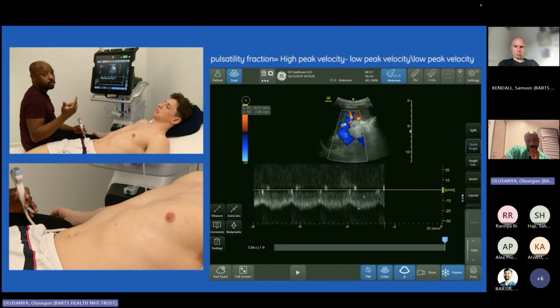So that's not pumping very well at all, is it? You look in the short axis, and the systolic function is equally bad. You put some color on. Looks like there's quite significant LV dilatation, and there's probably at least moderate MR secondary to the dilatation, so what we call secondary MR. It also looks like there's some tricuspid regurgitation there, and it also looks like there's terrible right ventricular function as well, and both atria are dilated.